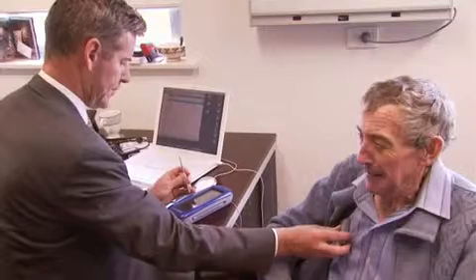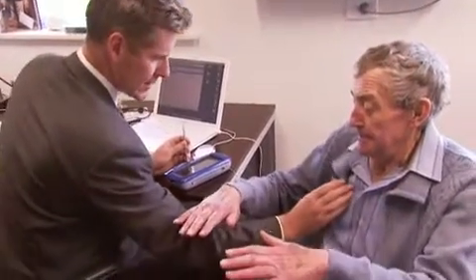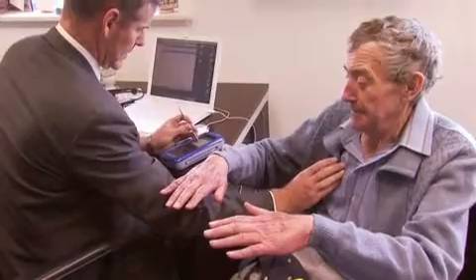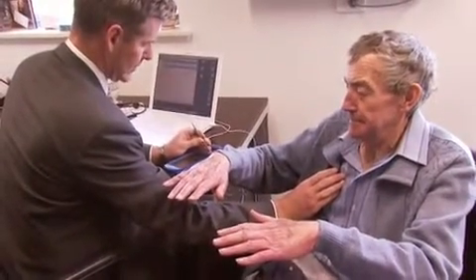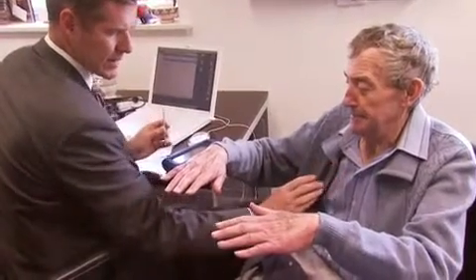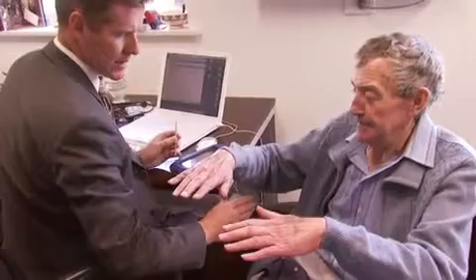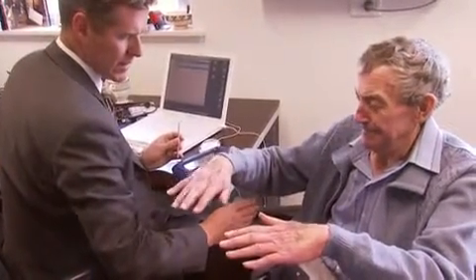Parts of the brain that we're delivering an electrical current to are thought to be participating in the circuitry that's involved in Parkinson's disease. And so what we're effectively trying to do is disrupt that process. By affecting what goes on in one part of the brain, we can influence the pattern of activity in various other parts of the brain, and that can have a positive benefit on their underlying condition.